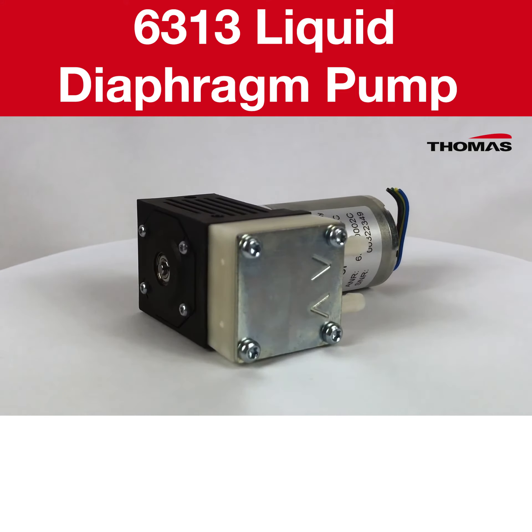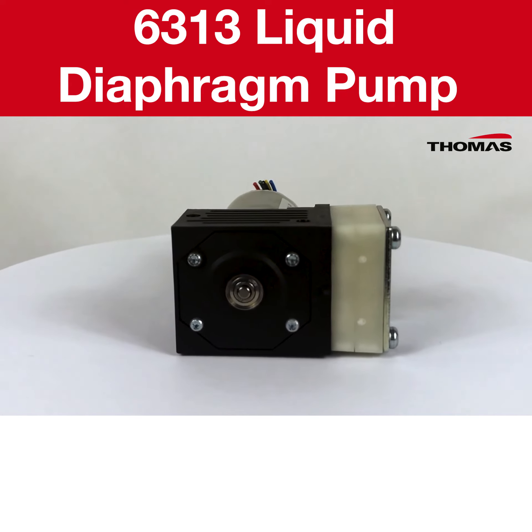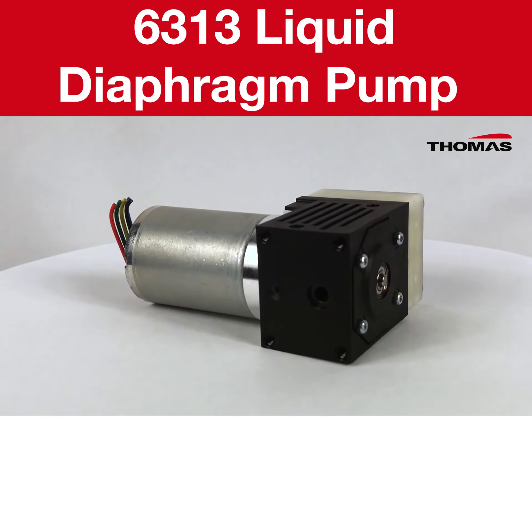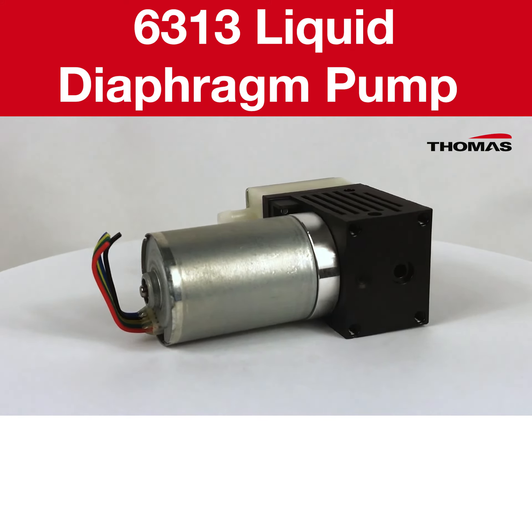Its motor range includes brushless and brushed DC motors for different duty cycles. Our 6313 is capable of excellent aspiration performance for liquids and air-liquid mixtures. Furthermore it offers you a robust design for the most demanding applications.